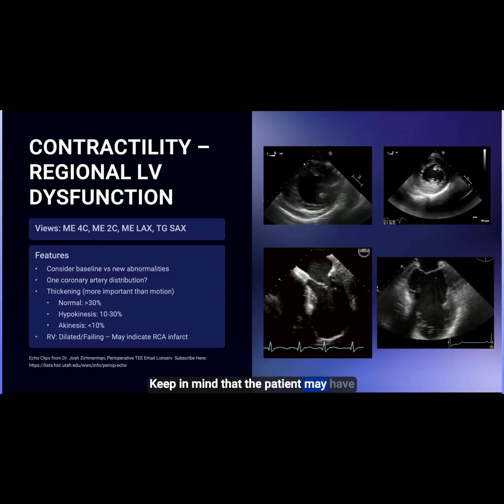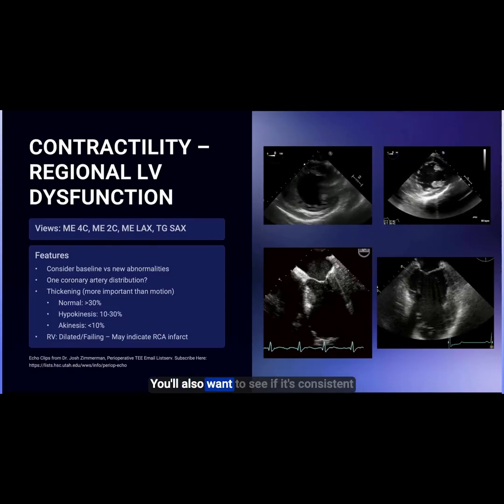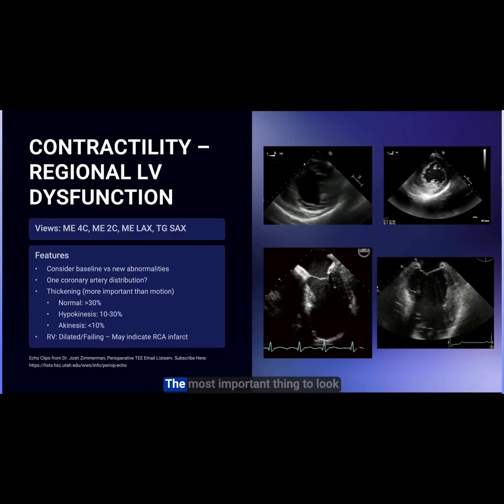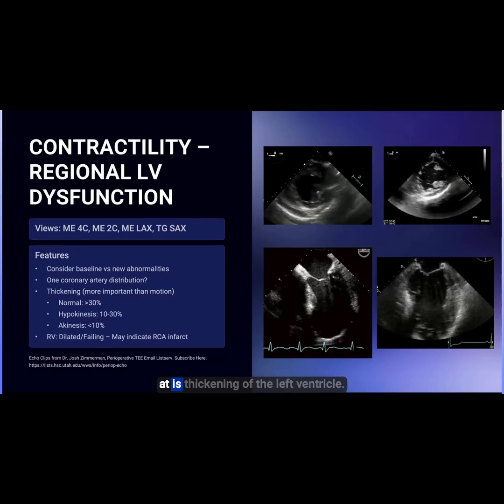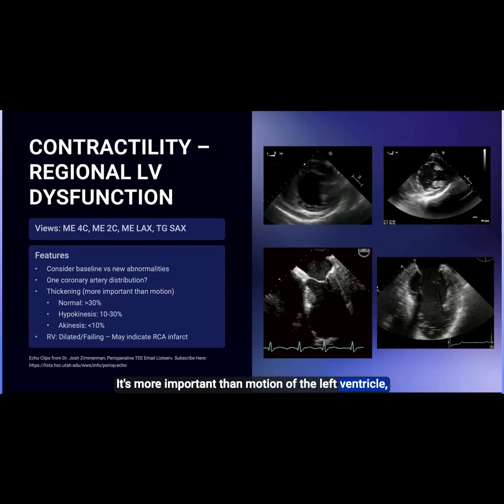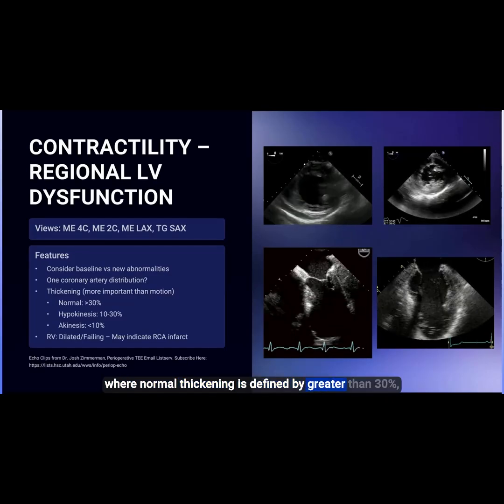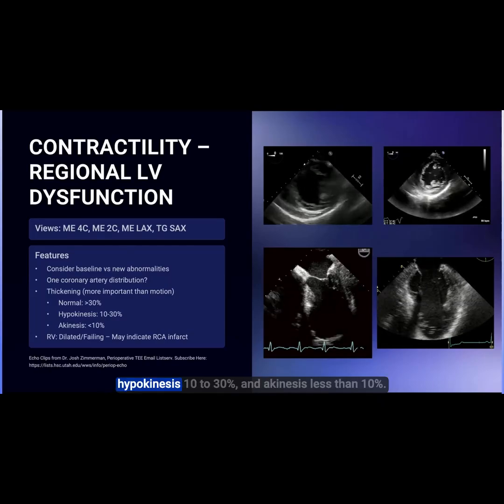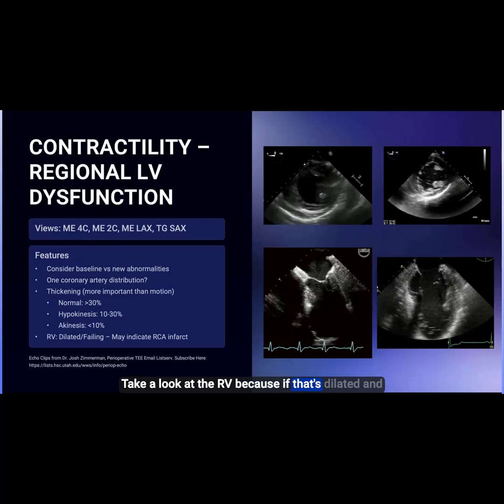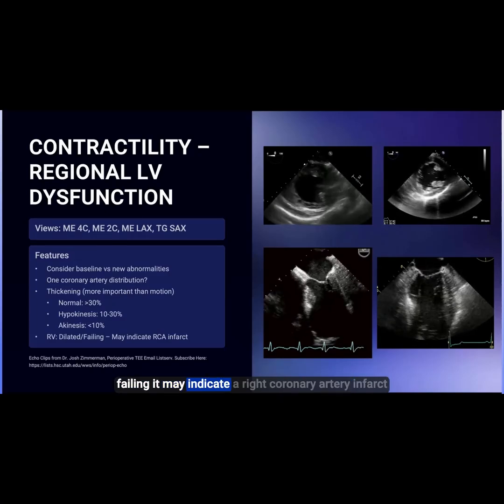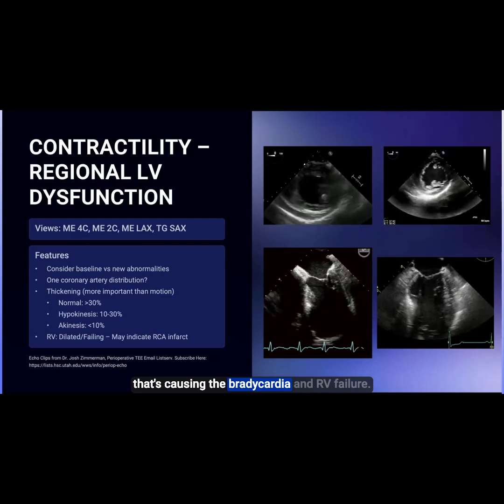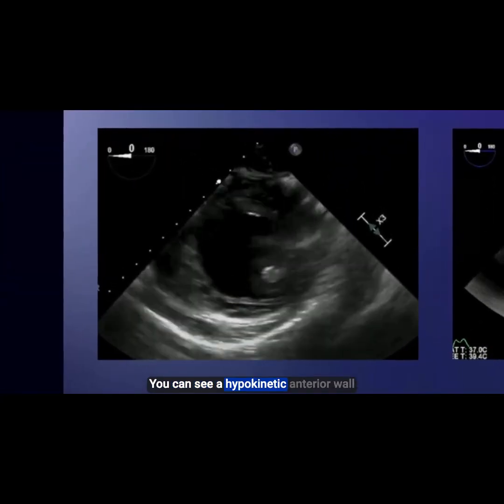Keep in mind that the patient may have already had baseline abnormalities. You'll also want to see if it's consistent with one coronary artery distribution. The most important thing to look at is thickening of the left ventricle — it's more important than motion. Normal thickening is defined as greater than 30%, hypokinesis 10% to 30%, and akinesis less than 10%. Take a look at the RV because if it's dilated and failing, it may indicate a right coronary artery infarct causing bradycardia and RV failure.